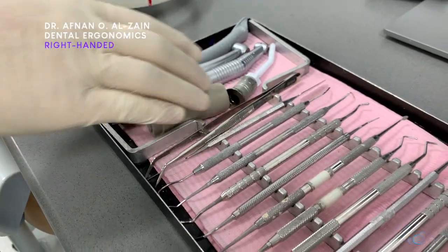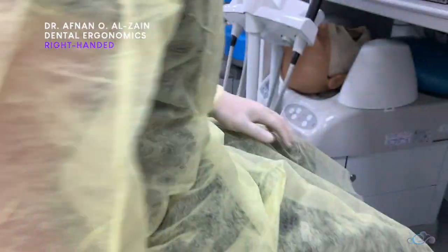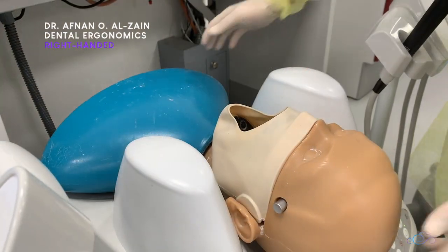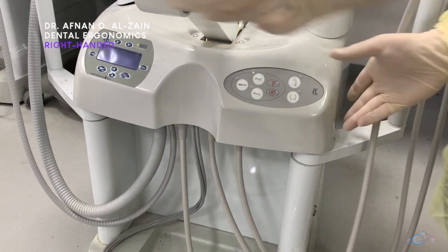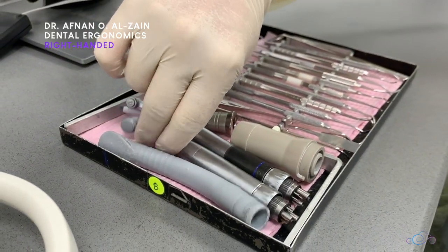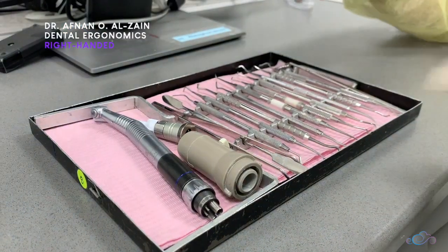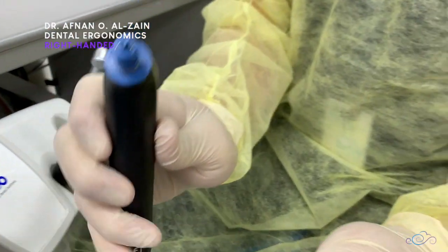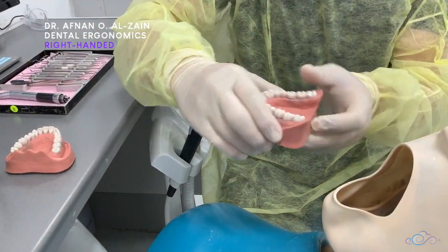After that, you're going to make sure your instrument tray is complete. Then you're going to move the dummy head and prepare your position. After that, you're going to install the handpieces, the high volume suction, and three-way syringe. Then you're going to install the upper and lower jaws in the phantom head.